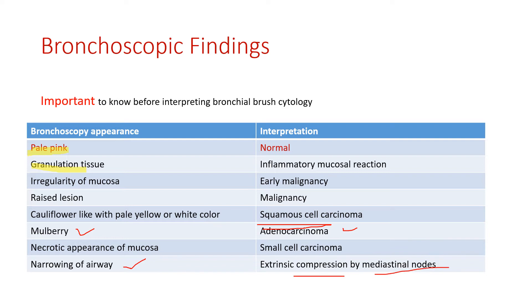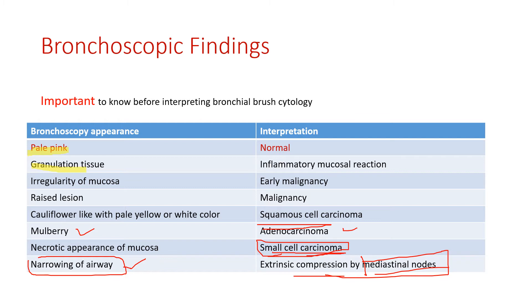Narrowing of the airway seen while proceeding with the scope is suggestive of compression by mediastinal nodes. A necrotic appearance of the mucosa is characteristic of small cell carcinoma. Granulation tissue represents an inflammatory mucosal lesion.